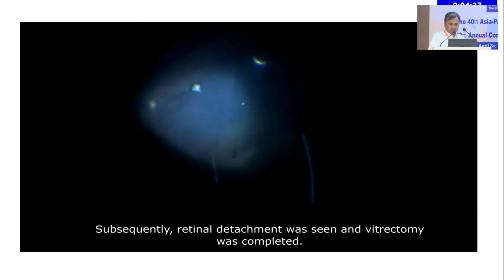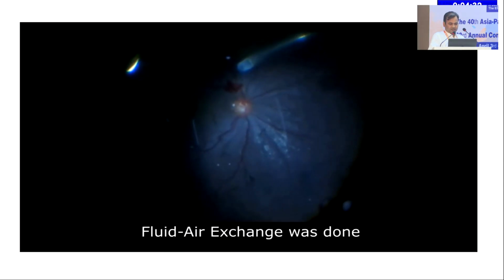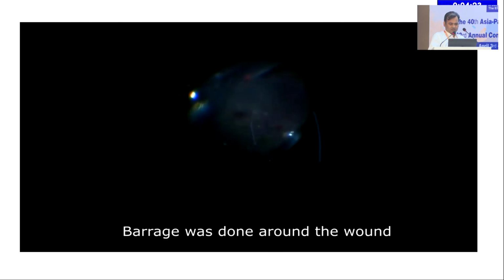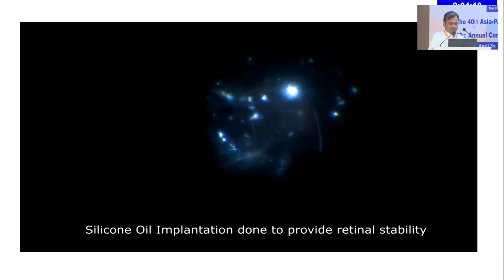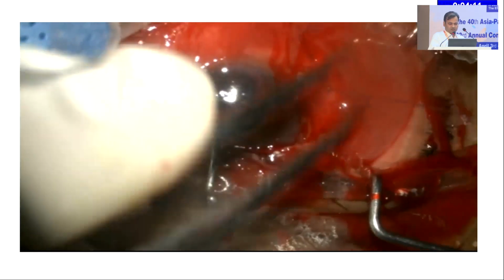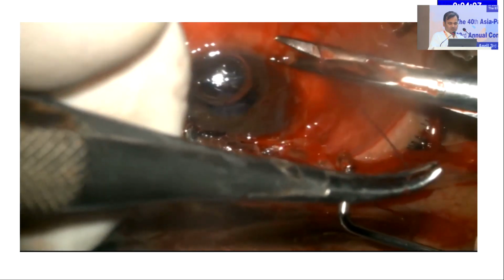After the removal, we found that there was a focal detachment at the site of the impacted foreign body. So then I did a complete peripheral vitrectomy, did fluid-air exchange, barraged the lasered area, and put silicone oil to stabilize the retina. Then I closed these three 23-gauge ports; because oil was there, otherwise no need to put the suture.